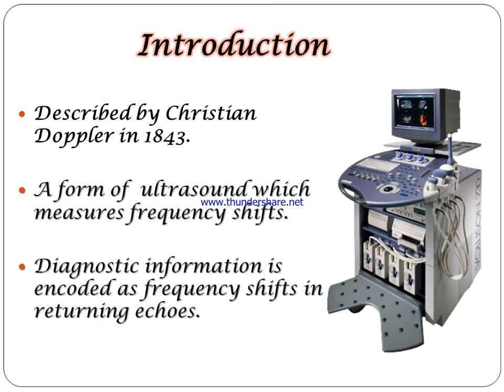Christian Doppler described the term Doppler in 1843. Doppler is a form of ultrasound which measures frequency shift. Doppler uses diagnostic information that is encoded as frequency shift in returning echoes.